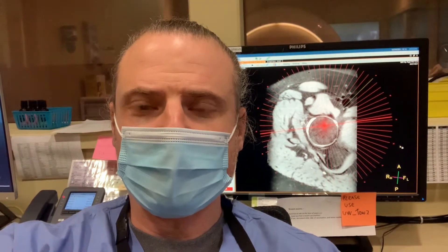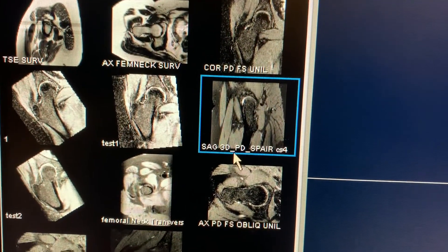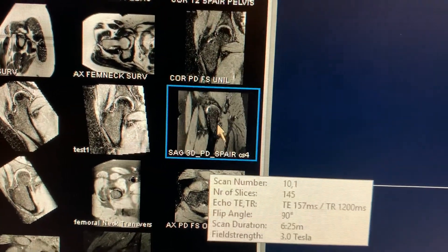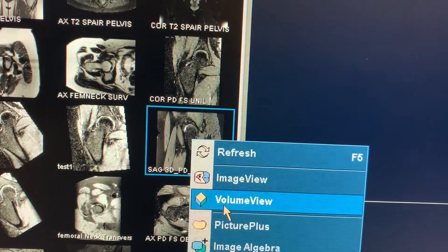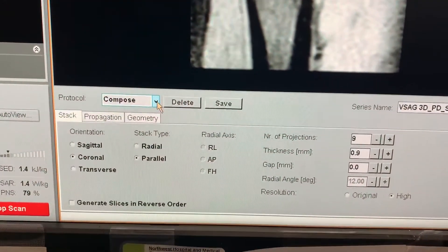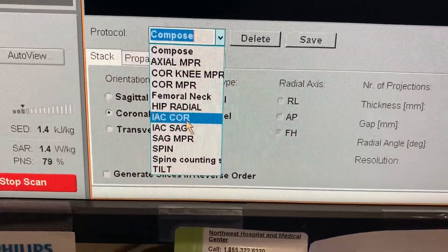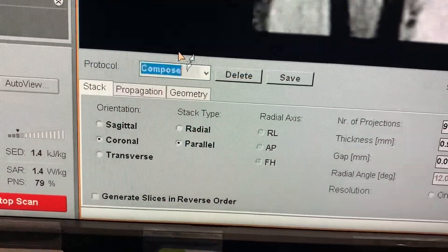I wanted to record a video about the radial 3D sagittal sequence that we got as part of our new hip protocols. Right-click on the sagittal 3D PD sequence and pull it to volume view. I created a template for radial hip — it says 'hip rail' here — go ahead and select that.